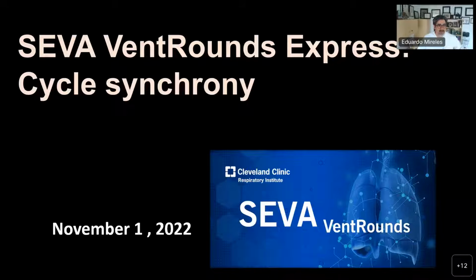So, some key items for you to be aware of is what we call the key knowledge to know. And the first one is the words trigger and cycle. These have been used through the literature in different ways, and those different ways sometimes cause confusion in what we call one thing. You may be referring to one thing, and I'm understanding another one. So it's good for us to essentially establish what each one means.